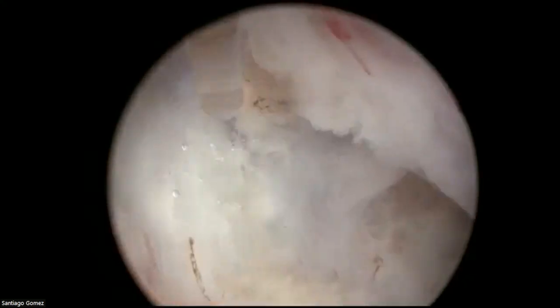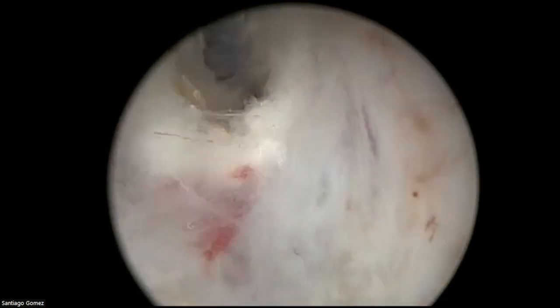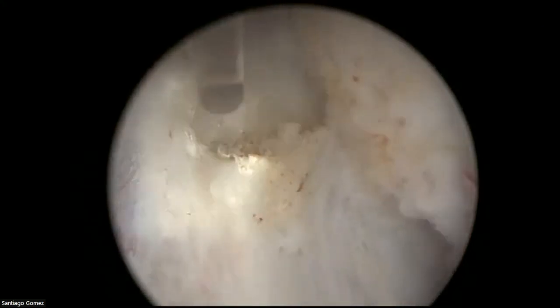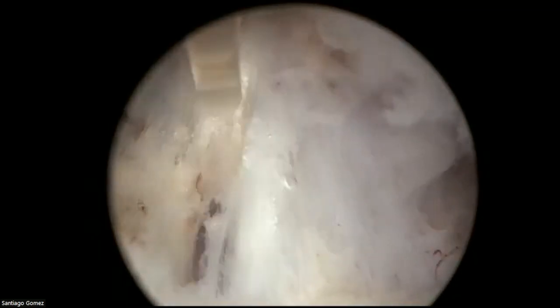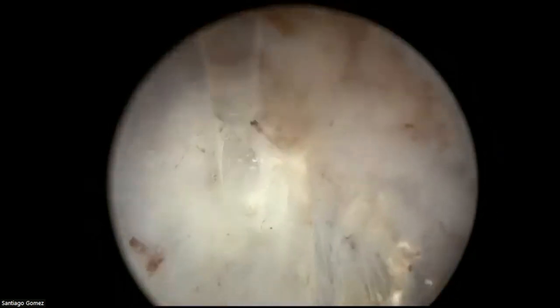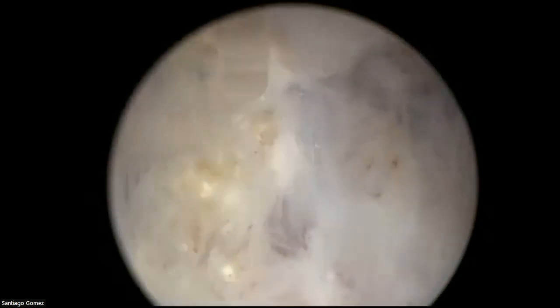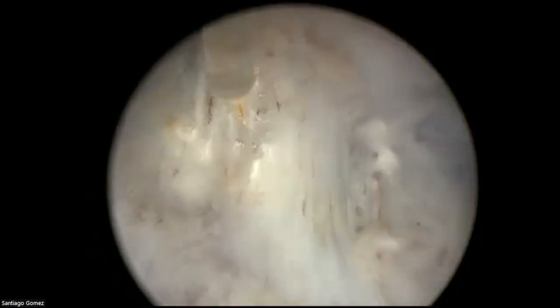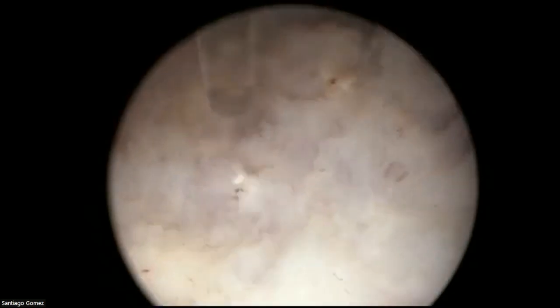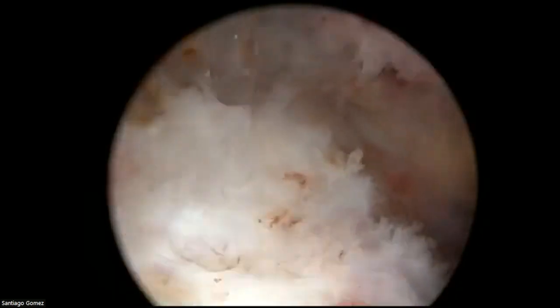This is the phase that I like to call mobilization phase and connection, because so mobilize and connect. So here, what I'm trying to do is to mobilize the apex a little bit, initially posterolaterally. And also I want to connect with the line of dissection that we had posteriorly, because these lines of dissection, if you think about them, and I want you to picture in your mind a transverse section of an MRI of the prostate, you know? If you picture that in your mind, you're going to perfectly recognize.